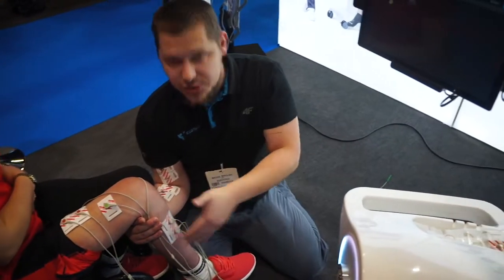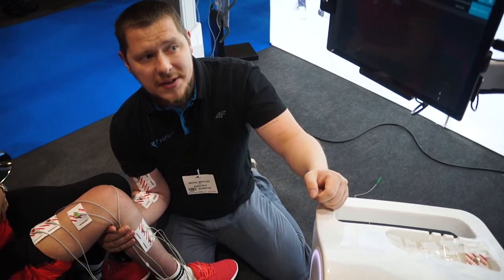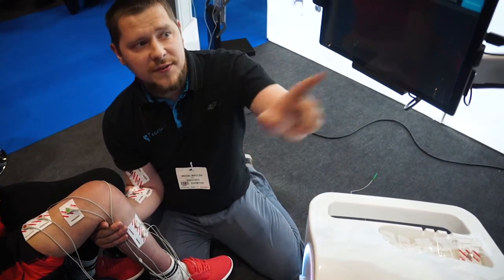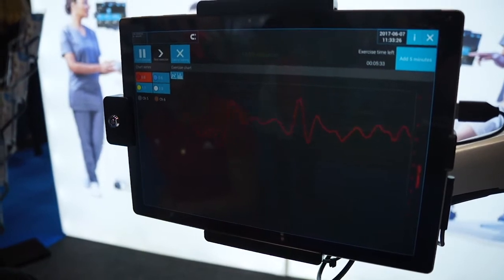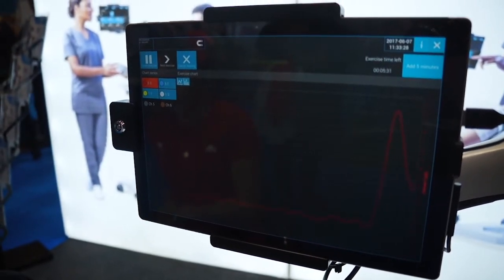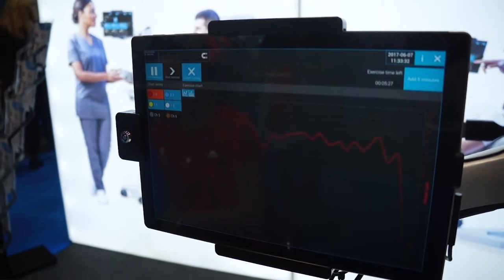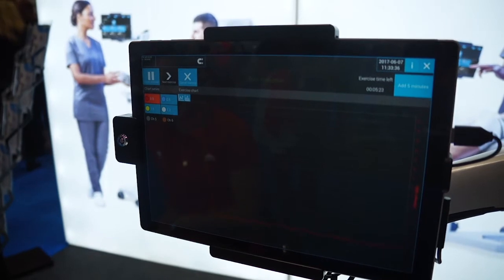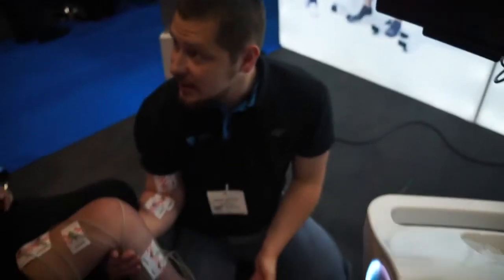We'll try to straighten down her leg and see if there's a difference with electromyography to determine whether innervation is present. So if you point at the screen, Paul, Izzy will try to repeat that as well. We'll try extending in three, two, one — hold it, hold it, hold it — and relax. You went up to 15 microvolts. It doesn't sound like very much, does it? It actually does.